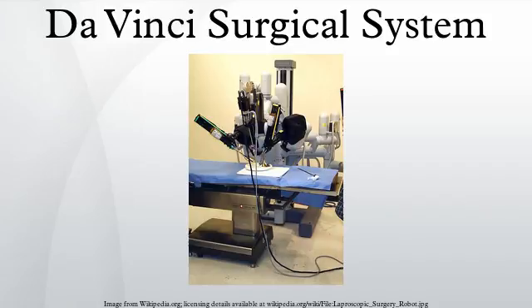There have also been claims of patient injuries caused by stray electrical currents released from inappropriate parts of the surgical tips used by the system. Intuitive counters that the same type of stray currents can occur in non-robotic laparoscopic procedures.